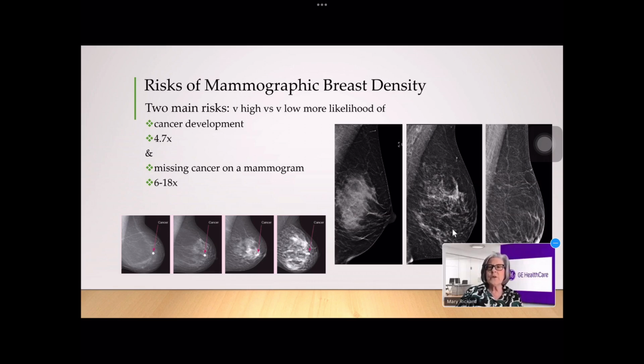And this is a little cancer up here, in an area in the prepectoral space where we shouldn't have densities. And so in fact that small density, which is a cancer, is relatively easy to see because it's in a strange place. But were it to be in this upper breast here, we would have a lot of trouble seeing it. Just as we can't see the cancer, which we now know is in this breast. It's just too dense.